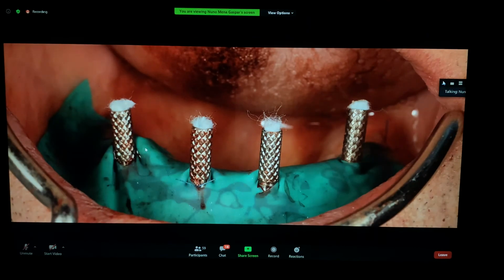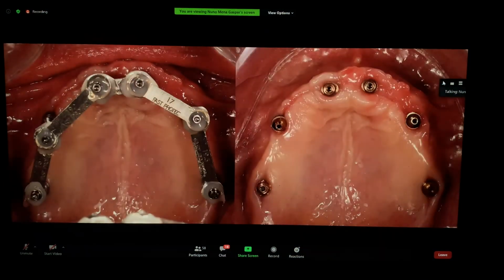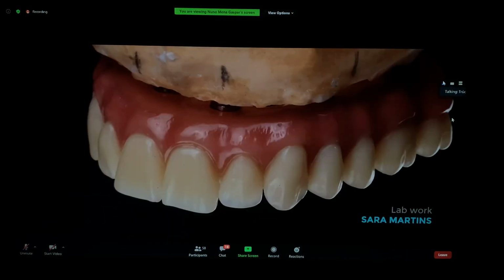In a big guy like this, let me show you. This is 14 teeth, okay? So in a big guy like this, with a bad occlusion, if I can do a good implant distribution, maybe I can offer these 14 teeth.